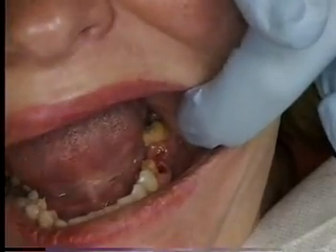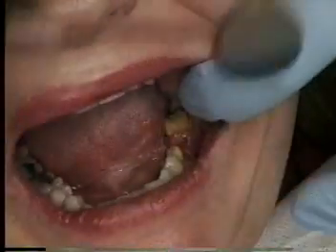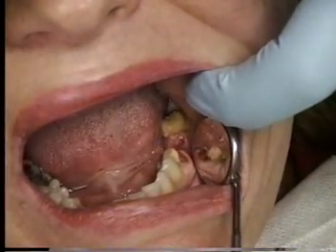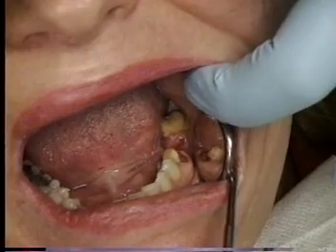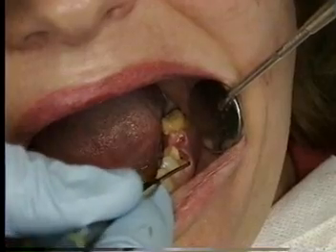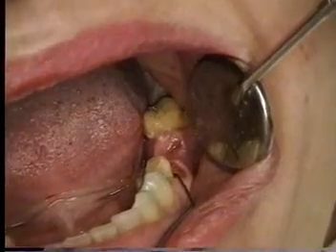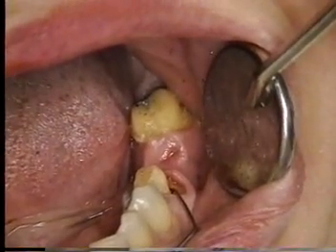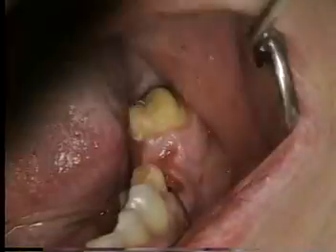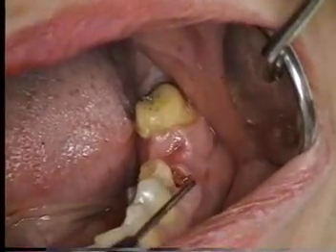There's obviously some pathology going on here with the second bicuspid. You can see there's an old pulp exposure — the pulp is exposed. There could also be internal resorption. But right there is where the pain is coming from. So we know now which tooth it is — it's not the molar in the back that's bothering her, it's this bicuspid.